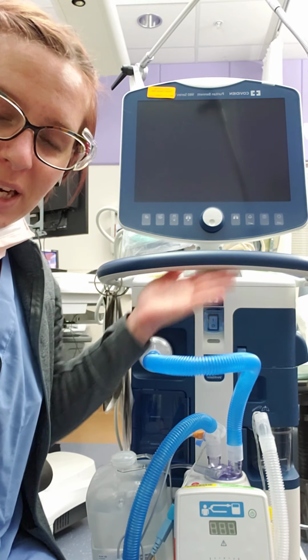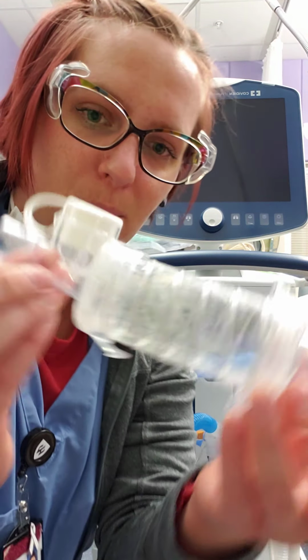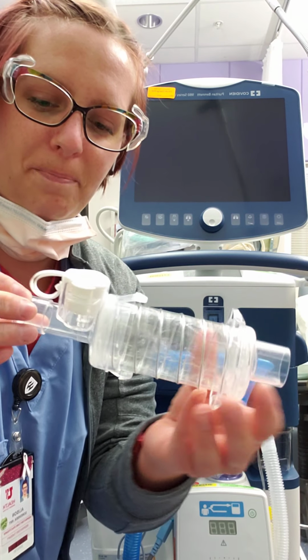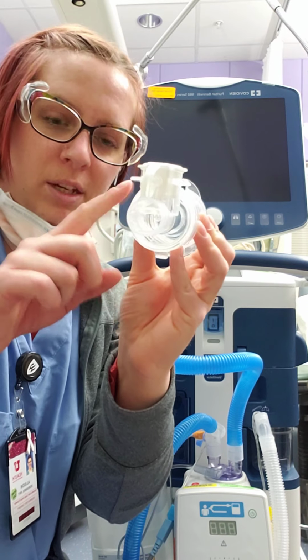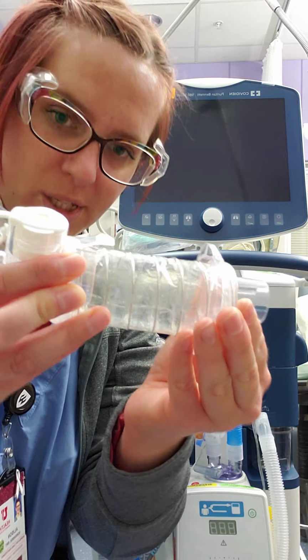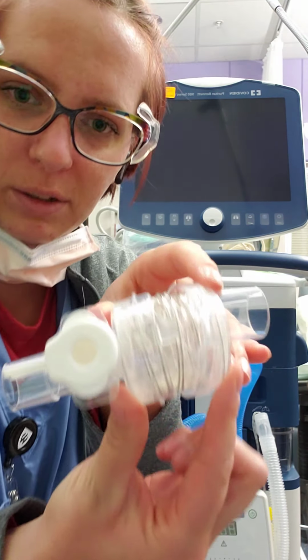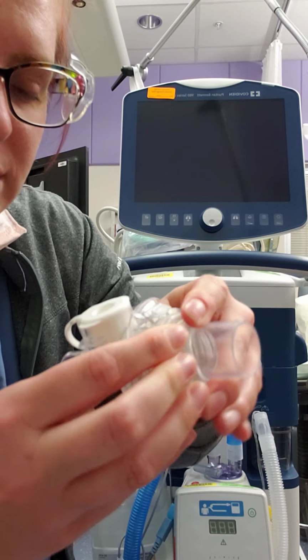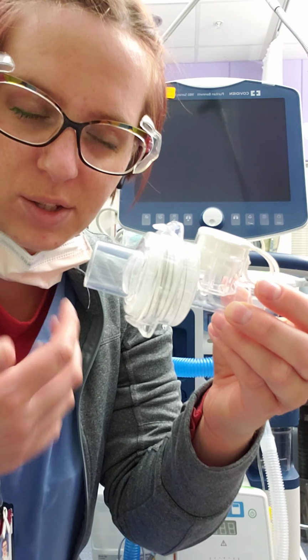So we have the Puritan Bennett 980 here with us. I'm going to show you, this is one of our inline MDI spacers. Let me show you the bits to it. So it's going through the end. This is a chamber, an internal chamber. This has springs in here so we can collapse it so that we don't have the little clips, so that it can collapse and not cause excessive dead space in the circuit.